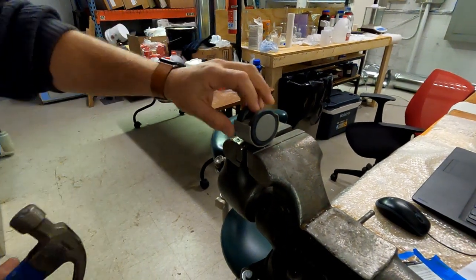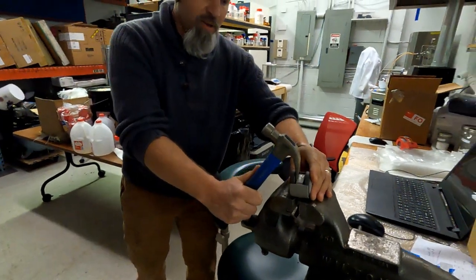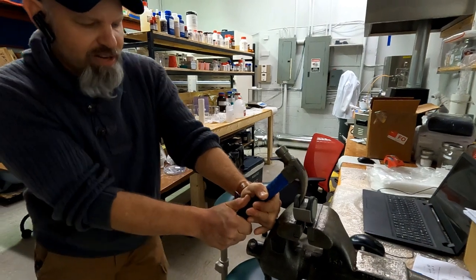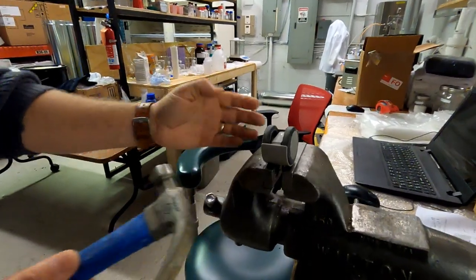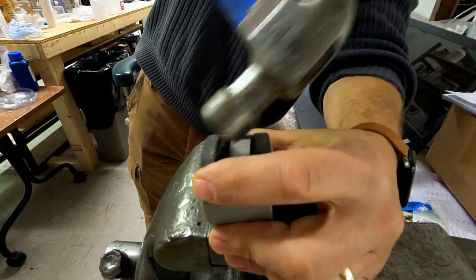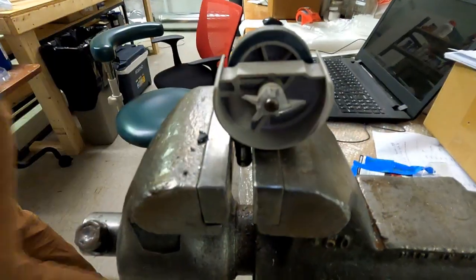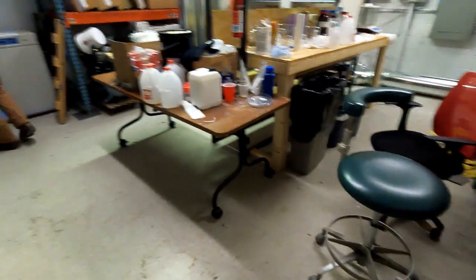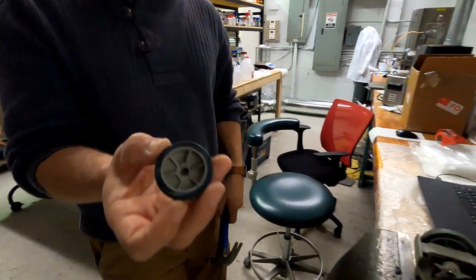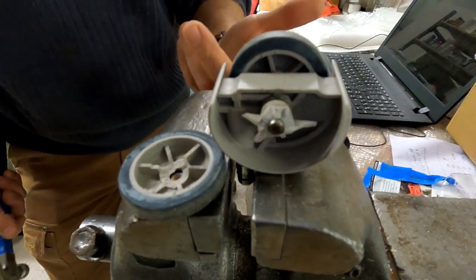So this is our vise, and to get these wheels off, you gotta pull and nothing happens. And so now, I'll show you. That was what it took to get the wheel off. And it flew across the room over here. Dude. So like DCI wheels, you just gotta replace them.